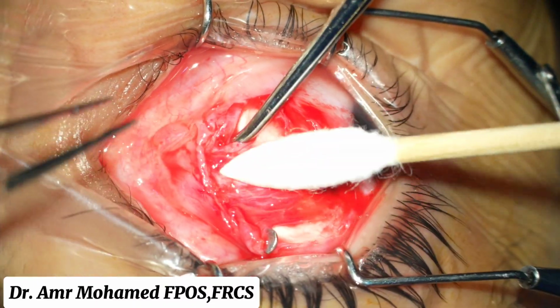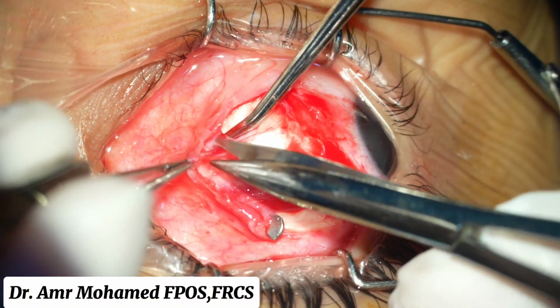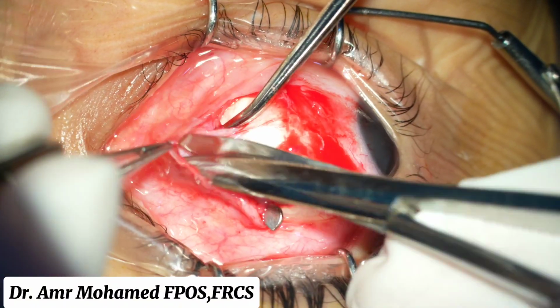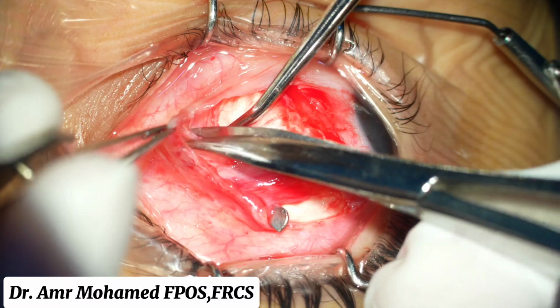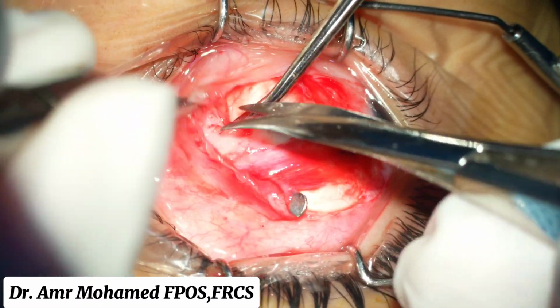Here I am cleaning the muscle, the intermuscular septum, and the tenon above the muscle.